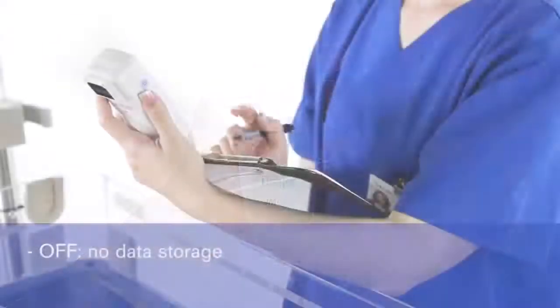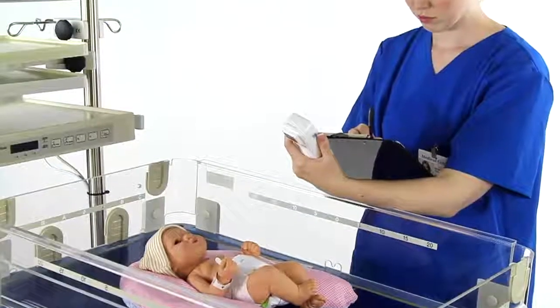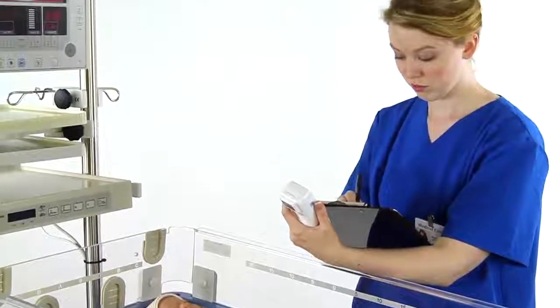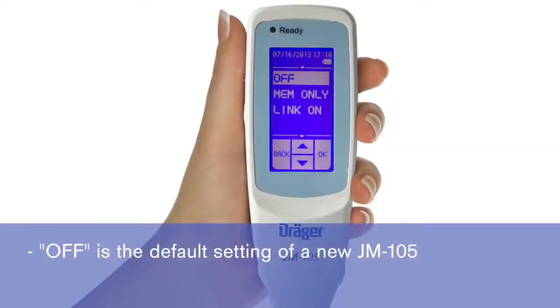Off means that the JM105 readings will not be stored. You will use the JM105 to take jaundice measurements and record them manually in the chart or electronic health record. Off is the default setting of a new JM105.